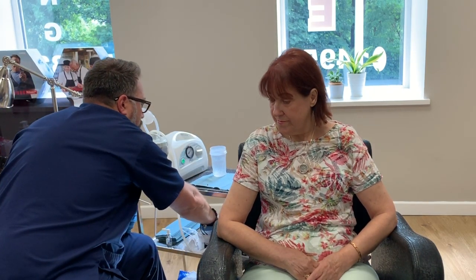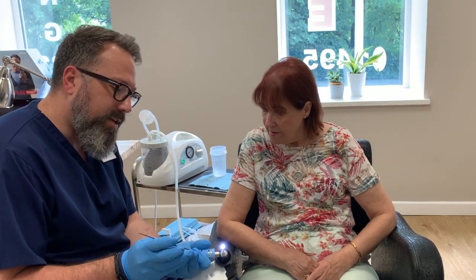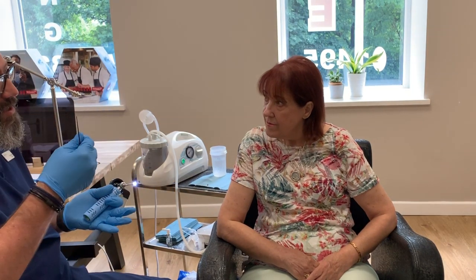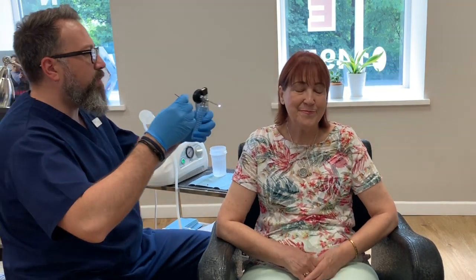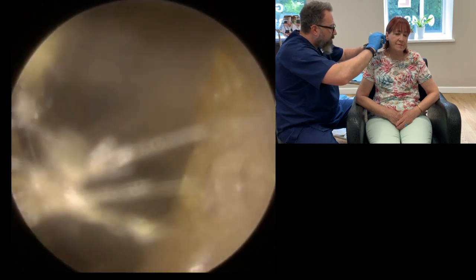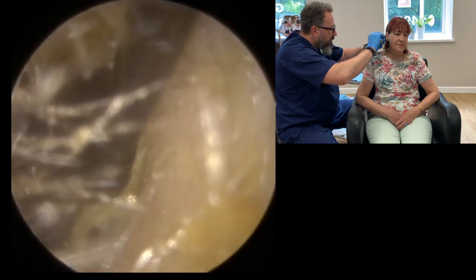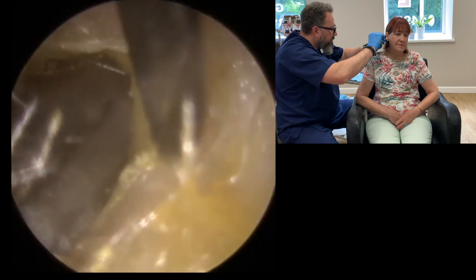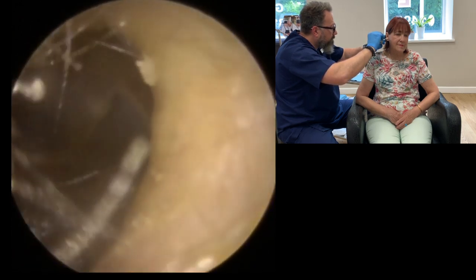Behind this I'm just going to use a slightly different tool now. It's what we call a Jobson horn — it looks like a little spoon for wax. So what I'm going to do is pop it in, tilt it, and just put it along the canal wall to get rid of this flap of skin. What's happening is every time I go in with the suction, it's lifting that flap of skin up, so I can't really do the wax behind it. So we're going to use the Jobson horn to take away some of this dead skin, flatten it out a little bit, just so we can get to that piece of wax. I'm just working my way around the outside part of the ear canal with the Jobson horn, trying to break off any little bits and press some of the rest of the skin towards the edge of the canal, which then allows me to get behind it with the suction tube without that skin flicking up.